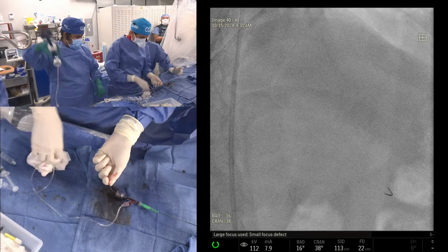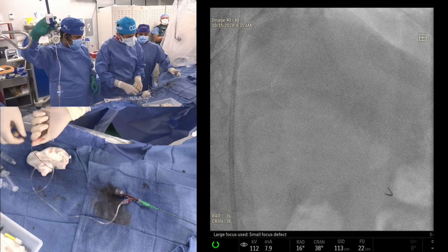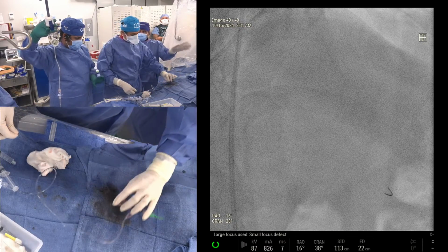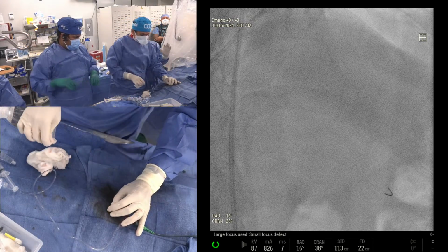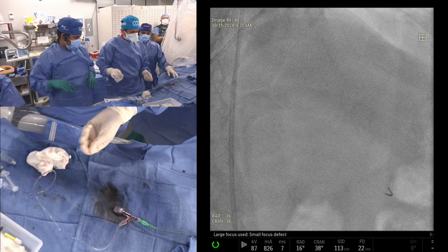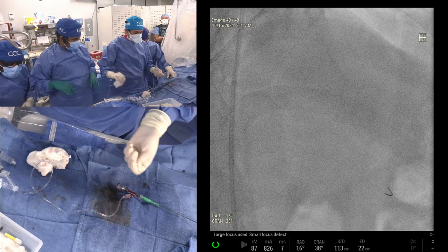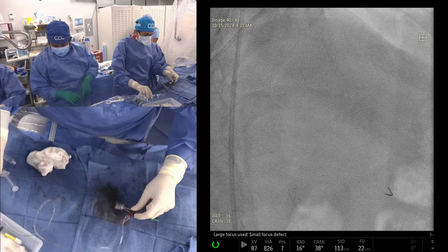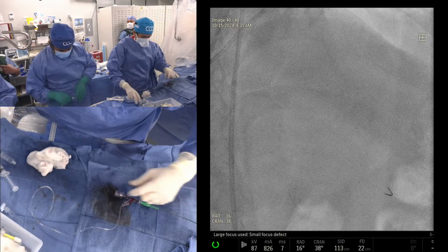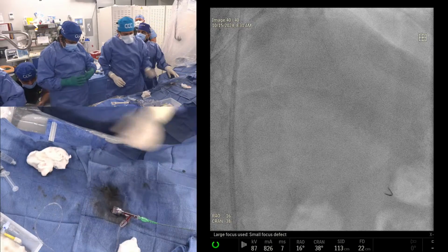The data have shown that subintimal dissection has a higher restenosis rate, and we shall come back with total occlusion. Therefore, the use of the Stingray and all that has significantly gone down. I understand, but that is what is being taught. Absolutely, just instinctively that has never appealed.